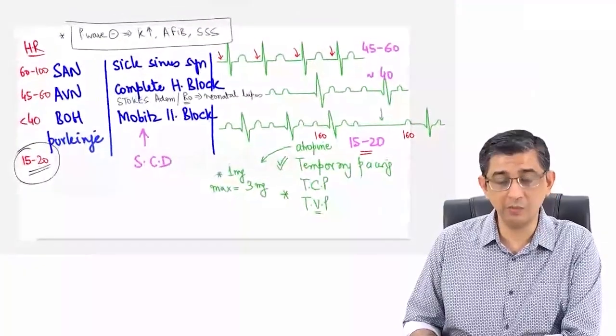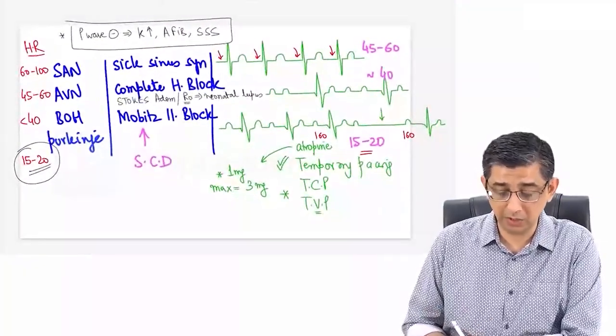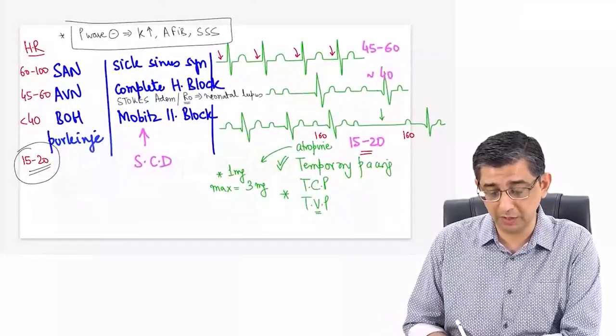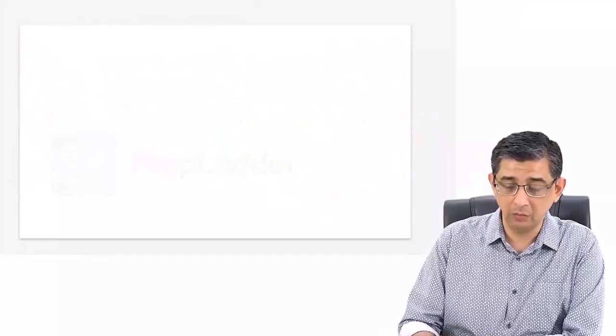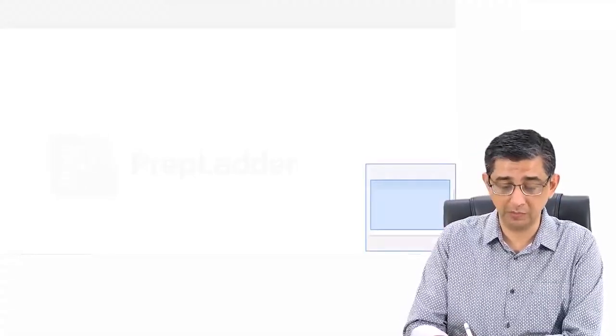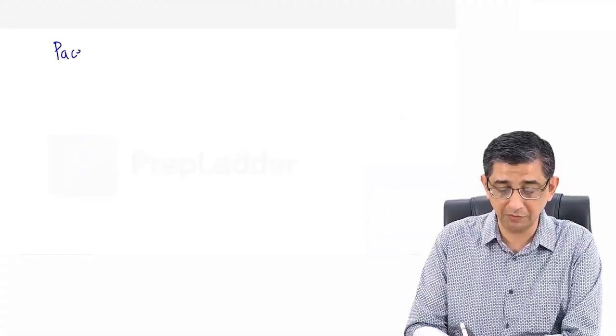And these are some technical aspects that I definitely want you to remember, so that in comparison, if they give you an ECG, you should be able to pick up the various varieties of heart blocks. Now, moving ahead in our discussion, I will be teaching you regarding where you put in the pacemaker and how this pacemaker circuit will be functioning.